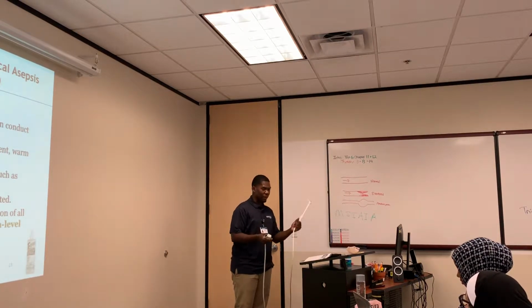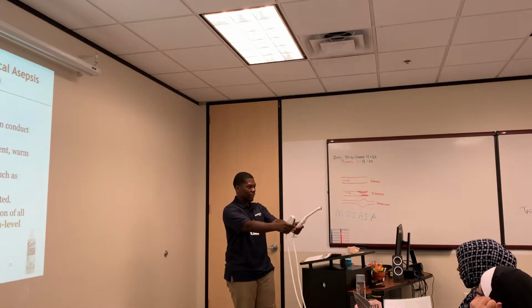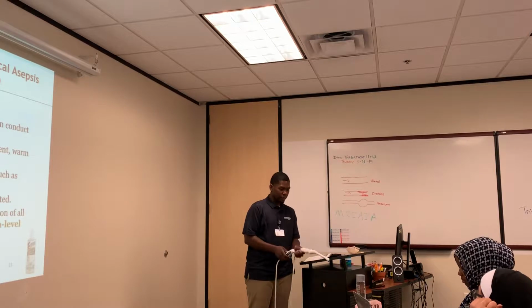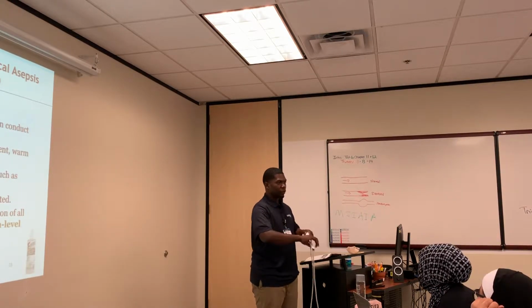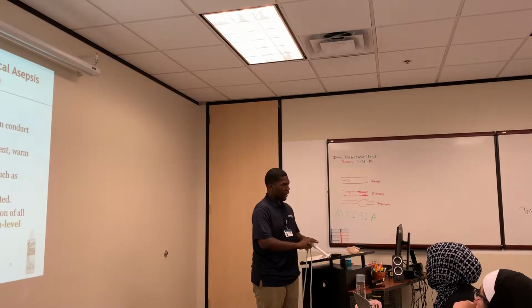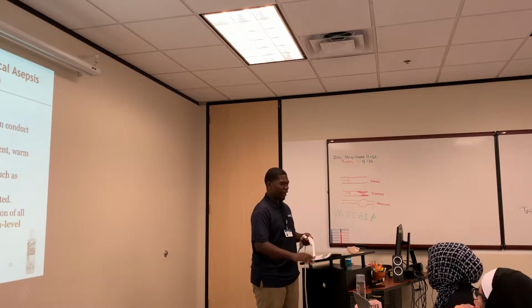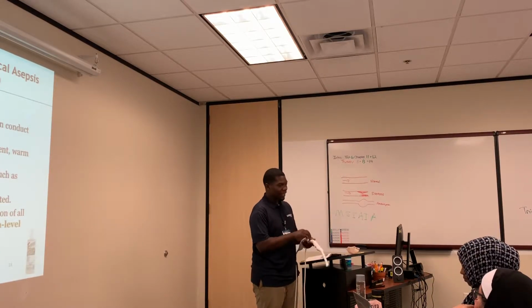But if it's coming out of a patient, make sure you have gloves on, because they're going to just hand it to you like this and tell you to go clean it. So the first thing we're going to do when we have to clean this, we're going to take it to the sink, and we have a sponge that we wash it down with to get all the gel off before we put it in the Cidex. So we kind of do a pre-clean. I forgot the name of the sponge. Man, I need to get back in the clinic.